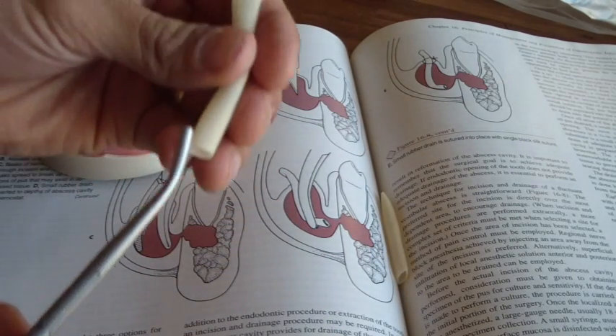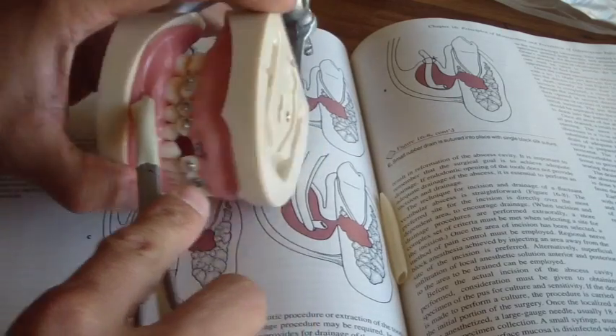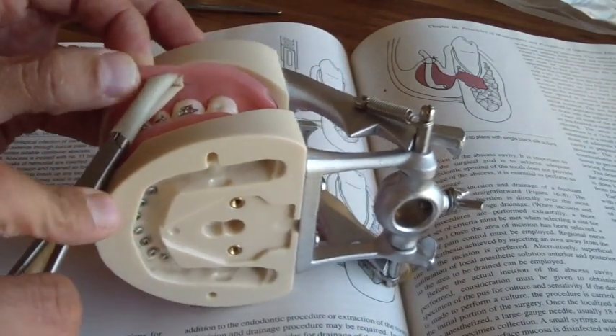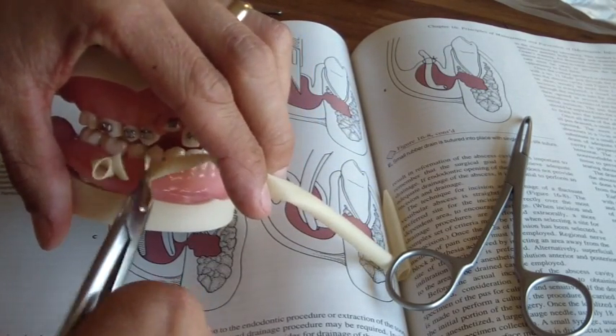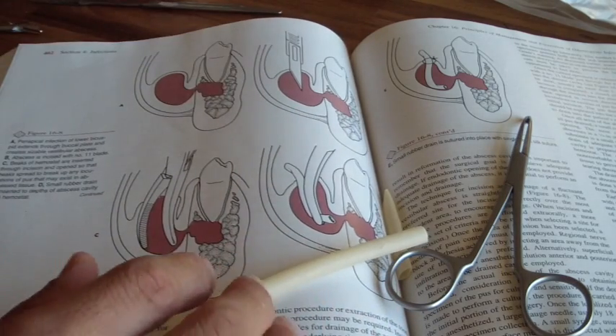I'm going to try to do this on the Denoform. Take the drain, put it on the hemostats on the end like that, give it a little bit of tension. After you've successfully performed the IND, place it into the wound, let go, leave it in there, then cut it and suture. That to me is much simpler. So again, the keys to successful IND are decompress, decontaminate — lots of solution to pollution is dilution — and drainage. Thanks to the surgeon who taught us, and cheers.